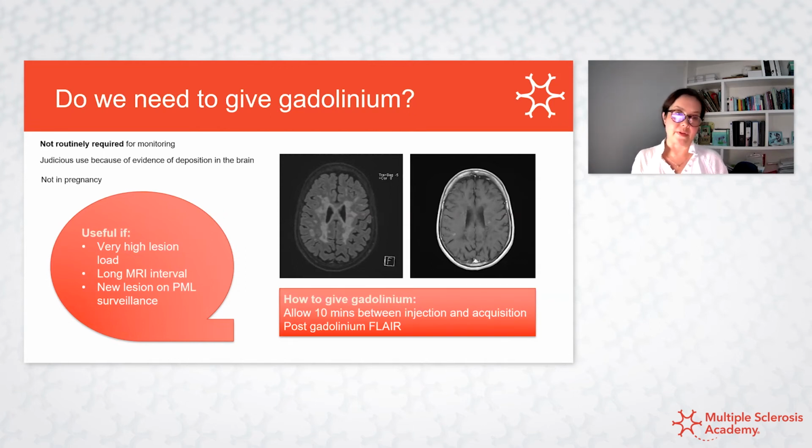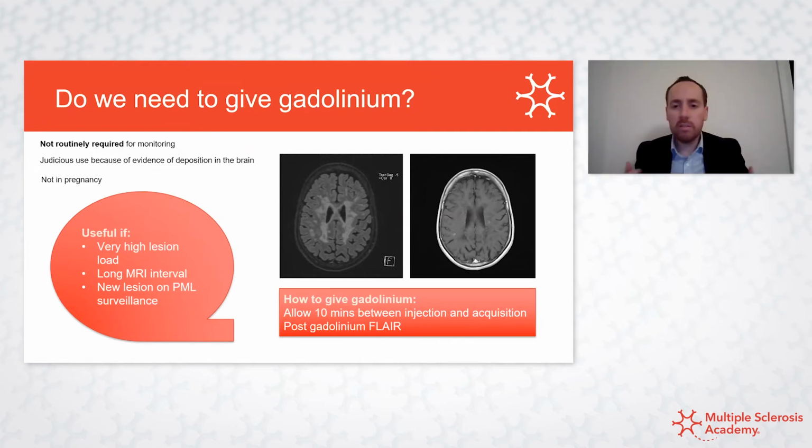This is where the use of a gadolinium enhanced flare first came to my attention, was in the oncology centres, and that really helps with conspicuity. So we waste very little time. And I guess a lot of this depends on context, doesn't it? So in the current era where we're increasingly using high efficacy therapies for not just people with aggressive MS, but we're offering them early, including first line, the chances of finding a new GAD enhancing lesion, say someone's been on a high efficacy therapy for 2 years, the chances are really low, right?